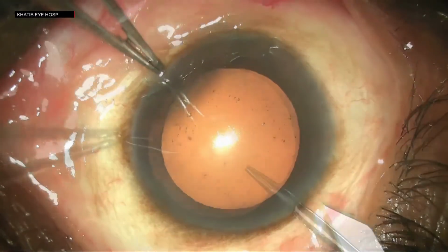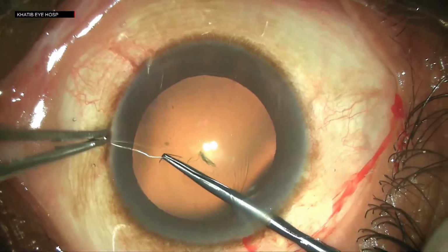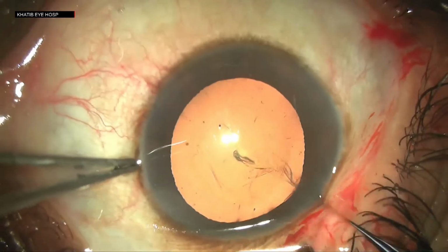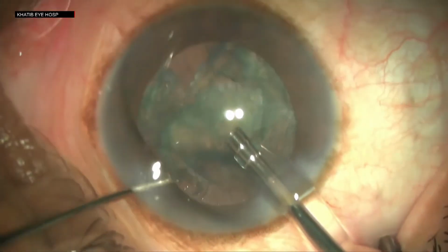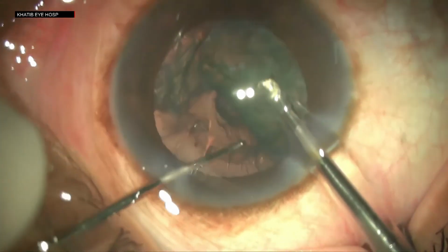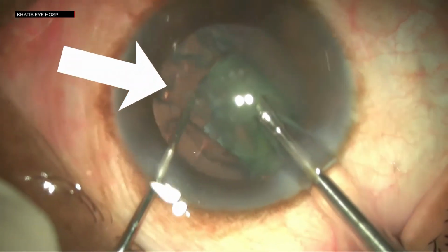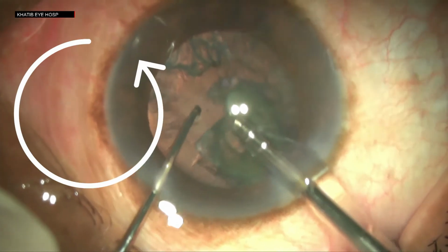So this is a routine surgery of a patient who is planned for second eye trifocal lens. The rhexis has gone well. The hydrodissection is done. Phacoemulsification of this softish cataract has gone on smoothly until now. The last piece aspiration is going on, and observe closely. This sudden surge. Rewind and see again. At this point, a PCR has happened.